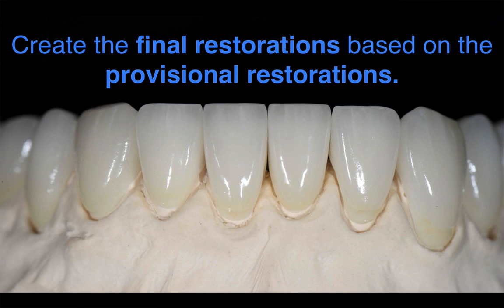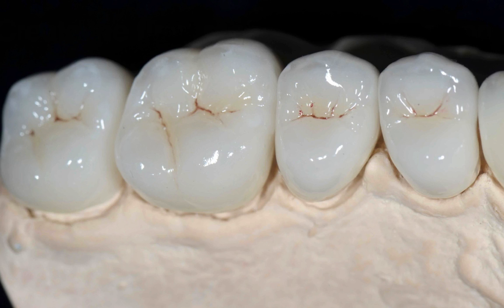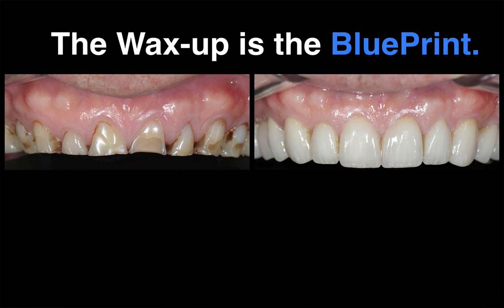The restorations are by my ceramist, Harold Heindel, from the Seattle area. He's a master dental ceramist. Beautiful anatomy, beautiful layering of the porcelain. But for me, the keys are beautiful fit and beautiful occlusion. Those are the keys to make my life easier, as well as the beauty and the aesthetics. So there's the before and after of the close-up view.